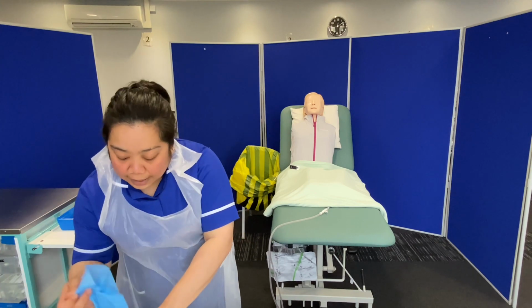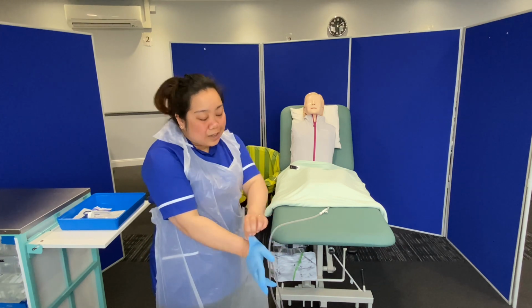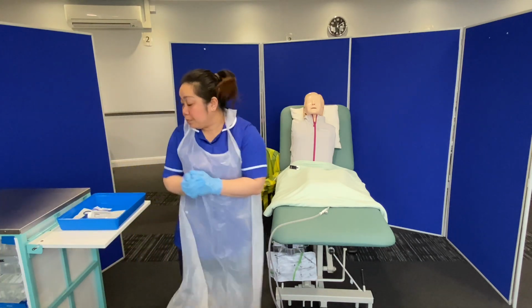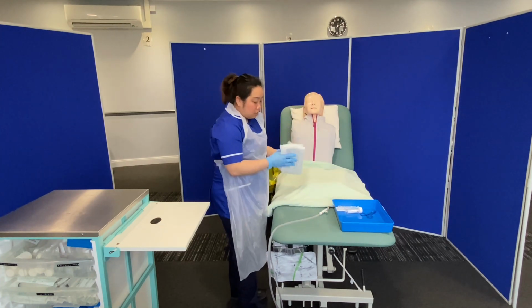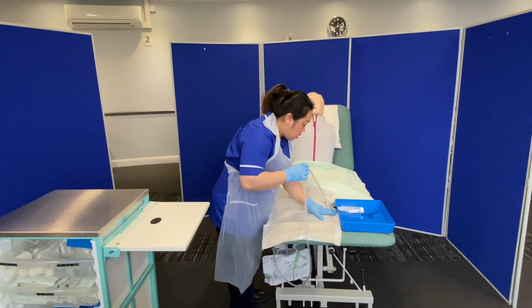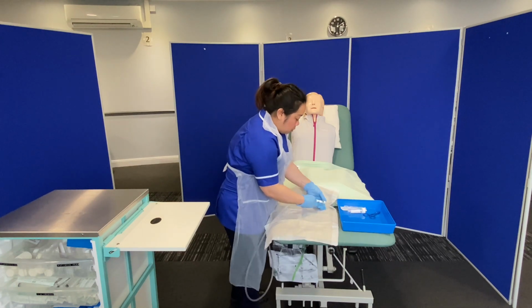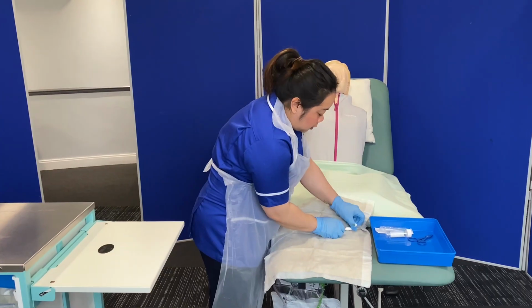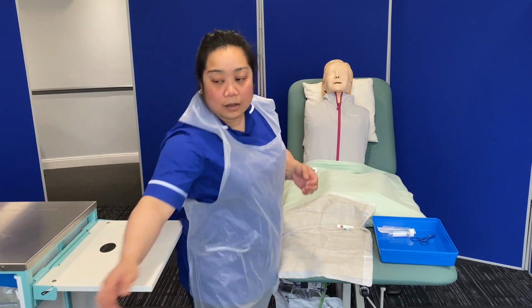Right. You feeling okay? I'm okay, thank you. Good. Like I mentioned earlier, this shouldn't hurt or you shouldn't feel any pain or discomfort. It will just be a brief procedure. Okay? Right, so I will need to use an underpad just so we don't soil the bed. There we go. Just going to manipulate that a little bit. Right? And because I've touched that, I'm going to change my gloves again. Do hand hygiene.